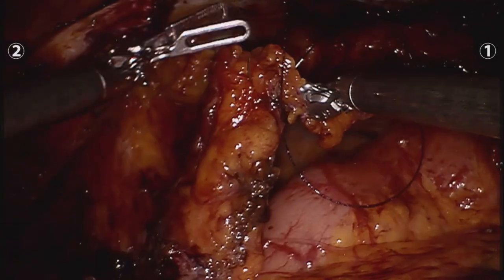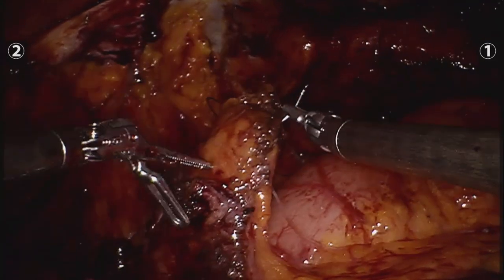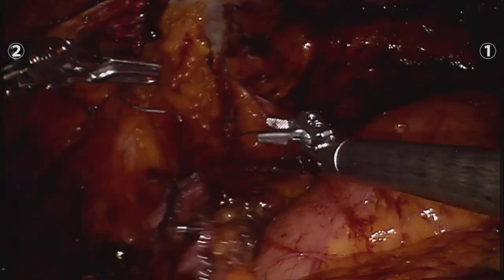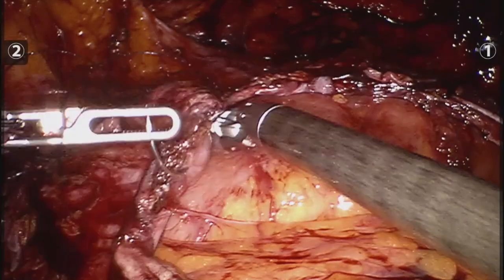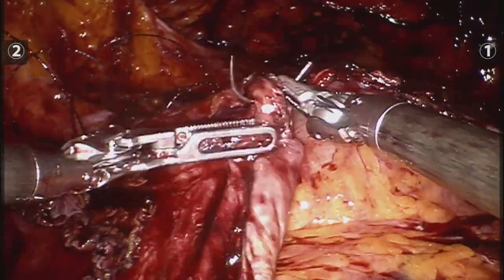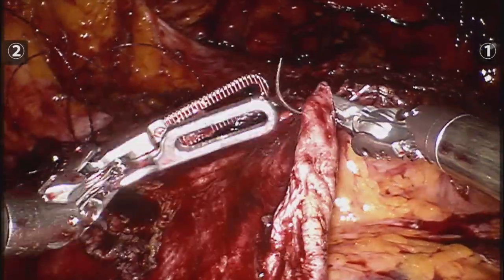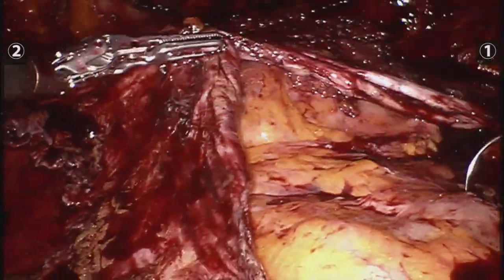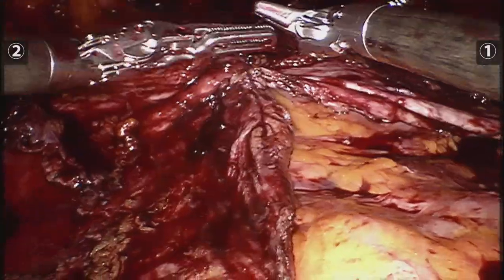We start the closure of the posterior rectus sheath using a number 2-0 V-lock suture, 45 centimeters. We closed it in the same fashion that very talented doctors do in the IHC — Dr. Flavio Melcher, Dr. Roxxon Liu — also very skilled, very meticulous, and great surgeries to learn from.